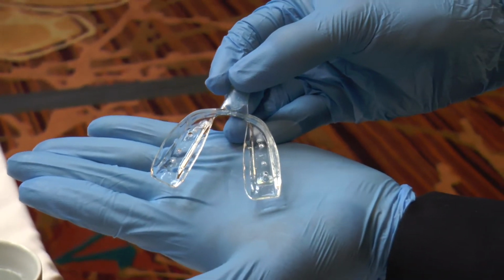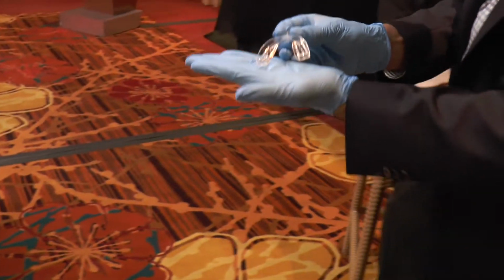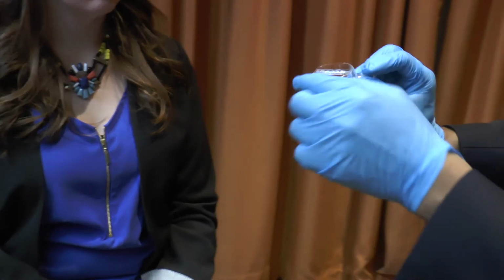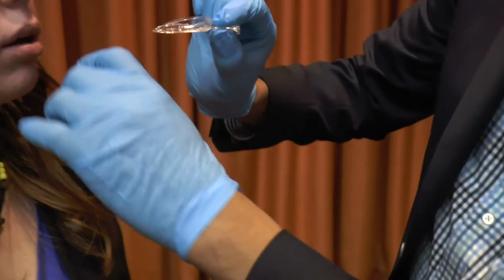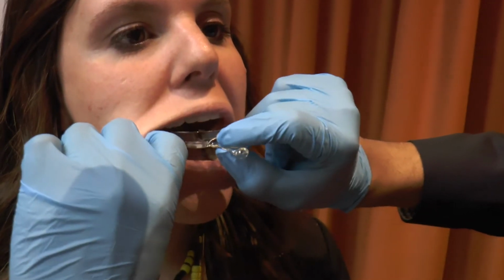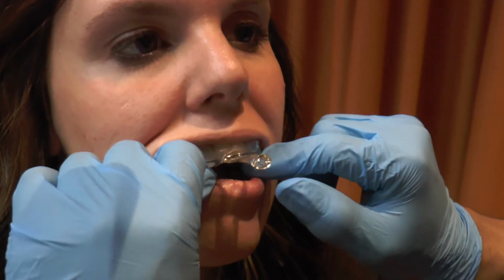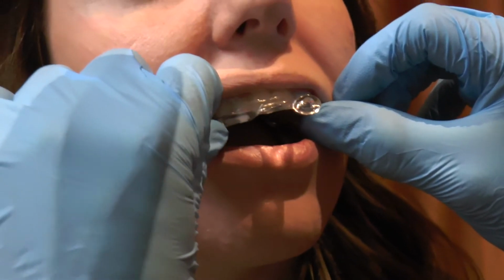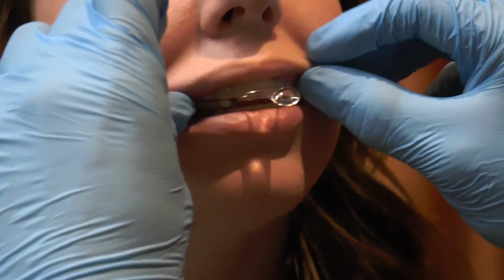So it's time for us to set this in the patient's mouth and get it molded to fit her upper teeth. You have to be a little careful here because the softening will allow the side walls to be a little bit softer, where it's easy for you to bend them over. What you're going to do is gently have the patient open, retract the cheek, and align it to fit the upper teeth as described earlier when we did the trial with the appliance. As you can see, the beak is centered with the nose, and now we're going to have the patient passively bite into it so she can keep it braced in place.